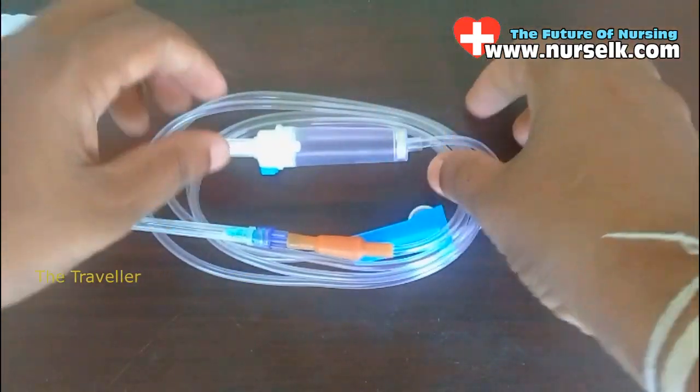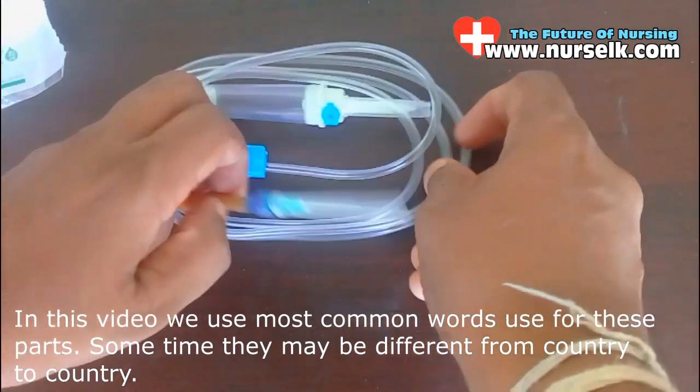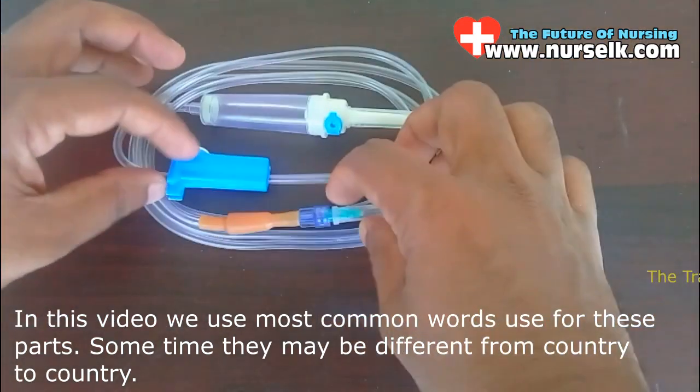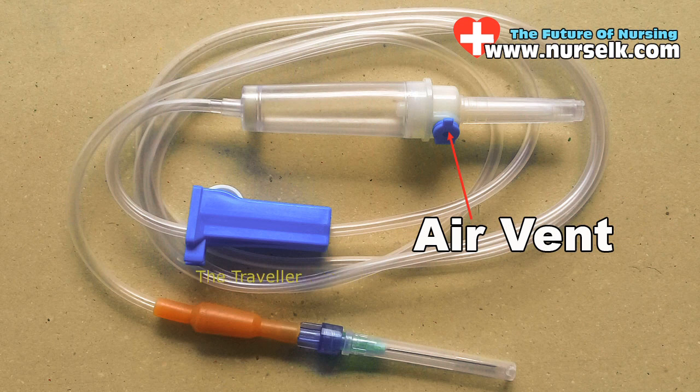In this video we use the most common words for these parts — sometimes they may be different from country to country. This is the spike, and it is covered with a cap called the spike cap. Next is the air vent.